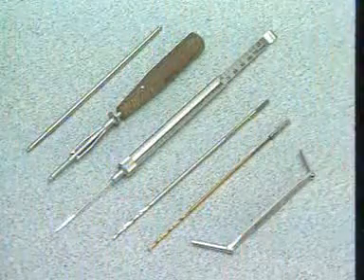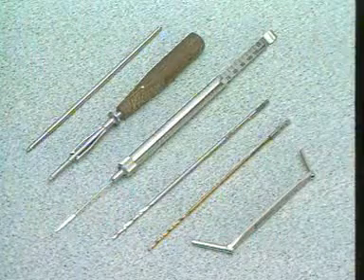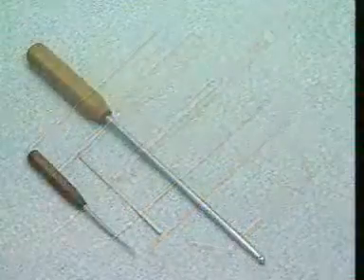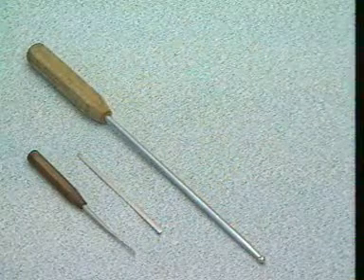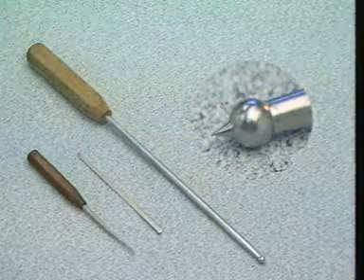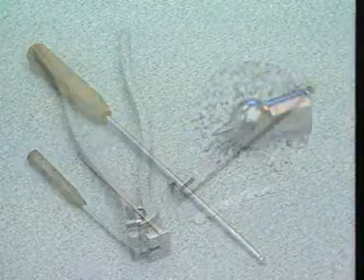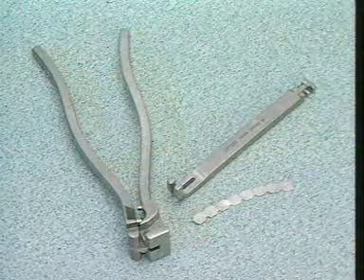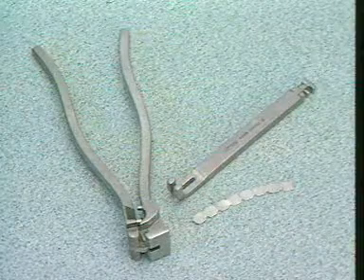For this exercise, we'll use part of the 3.5 instrument set. To hold the fragments in place, we use a periosteal elevator, an osteotome, and a bone-holding rod with pointed ball tip. The template serves as a model for bending the plate, with the bending pliers for reconstruction plates and the bending iron.